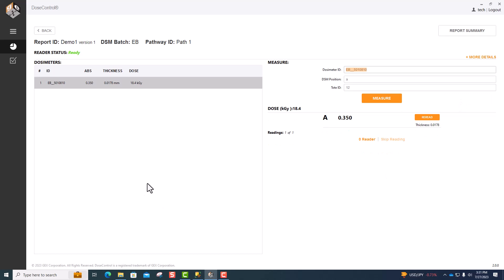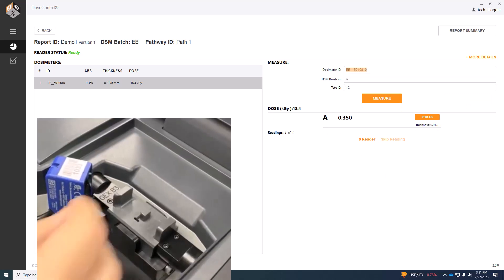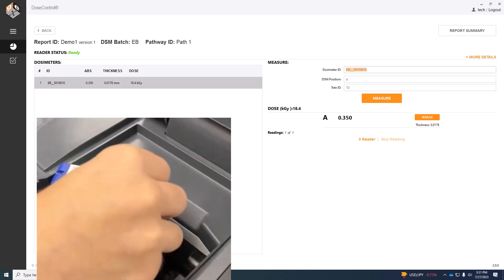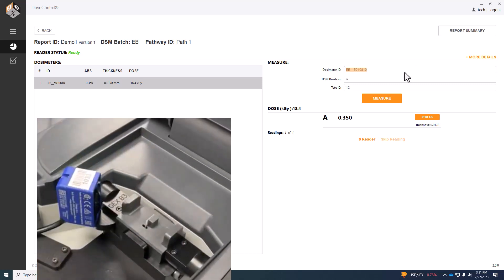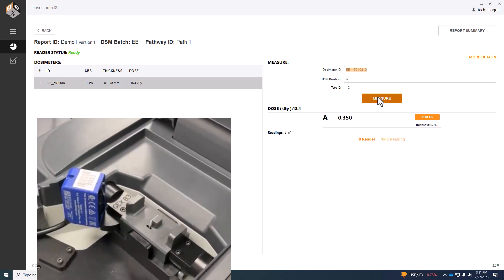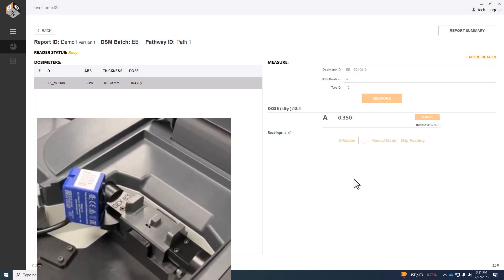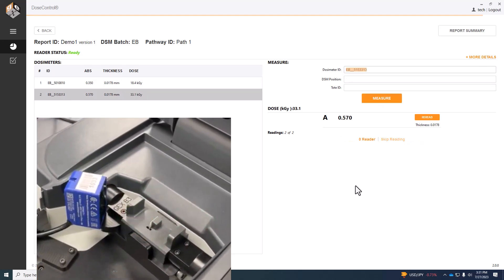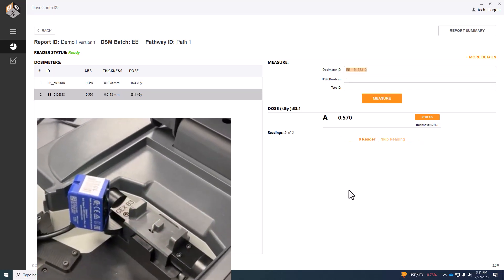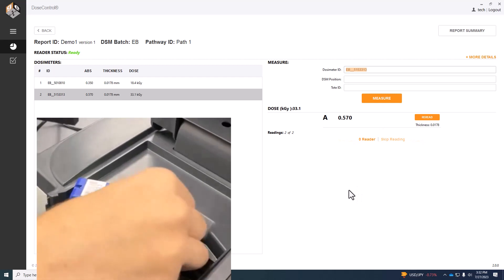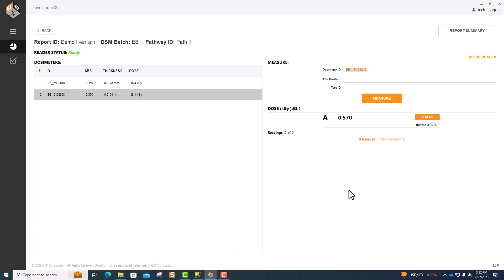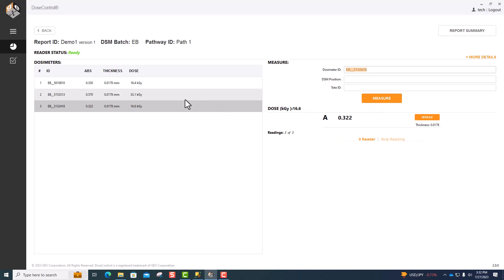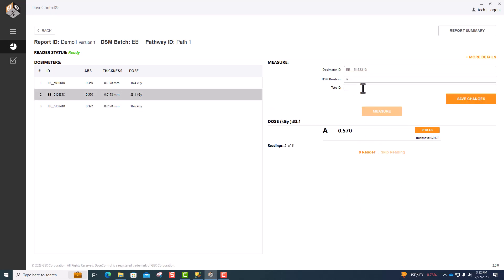Once complete, you can put another dosimeter in and measure. You can also measure all required dosimeters and then go back and input dosimeter positions and tote IDs.